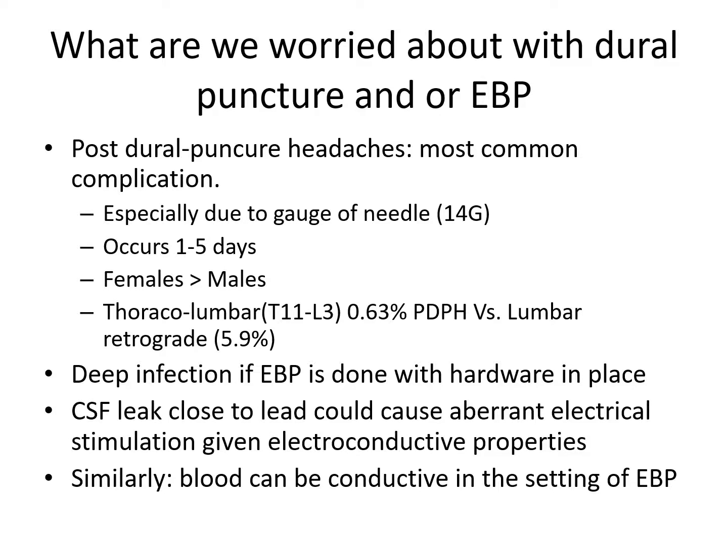When considering how to treat a dural puncture, we can consider the natural history of a dural puncture. It is more common with larger needles, Quincke needles, which have a cutting bevel, as compared to Whitacre and Sprotte needles, which have a pencil point tip, and it occurs in females more than males, and often 1 to 5 days after the procedure. Performing a blood patch at any time has potential risks and benefits.